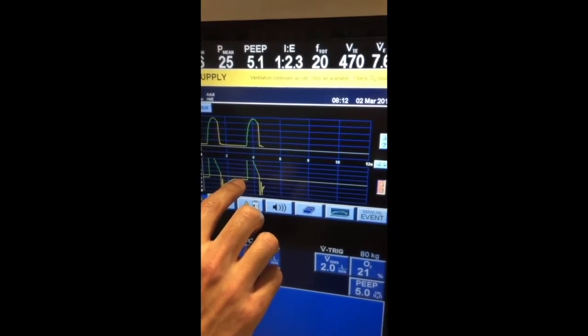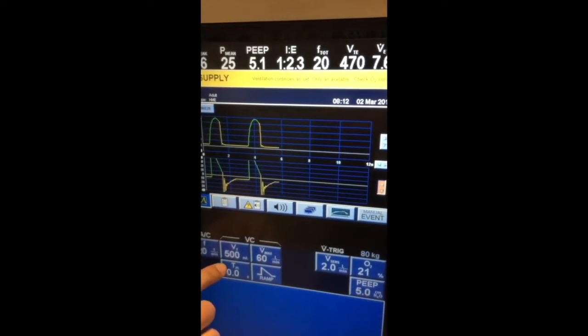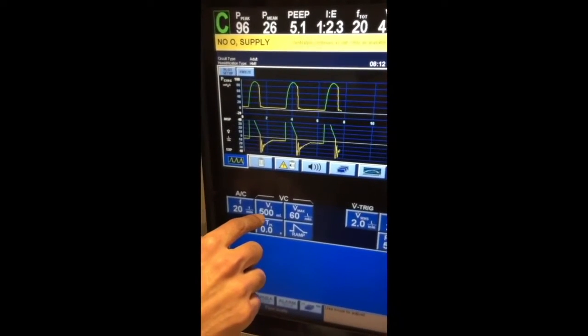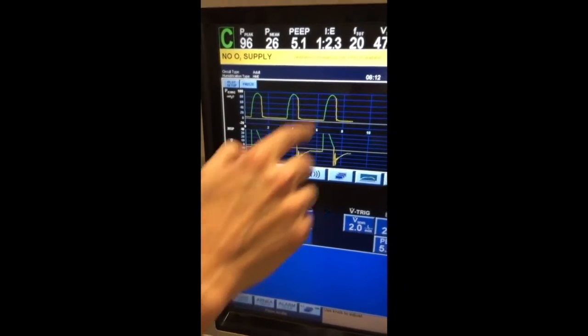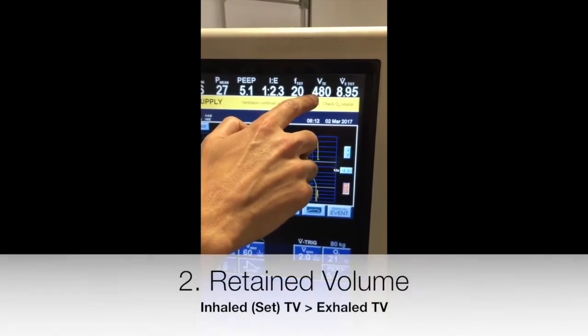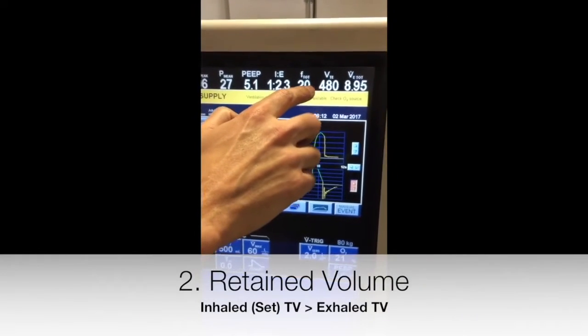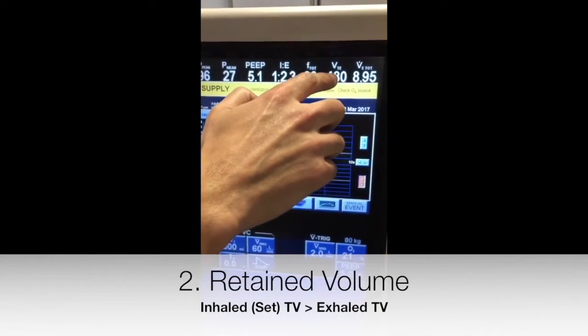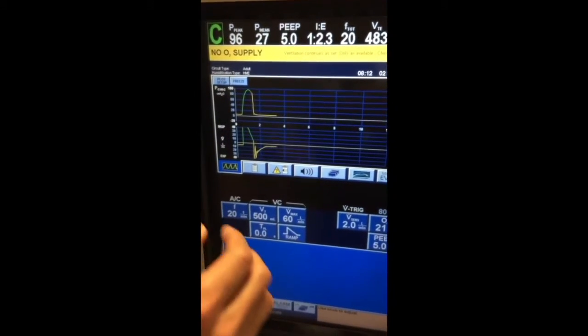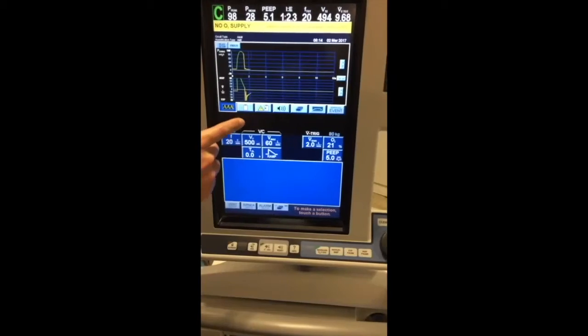Here you can see that it's not reaching zero. The second, but less reliable way, is by looking at the inhaled tidal volume, which is 500, and looking at the exhaled tidal volume, which here is less than inhaled, indicating auto-peep. But after several breaths the volumes equalize, so you can't rely on this.